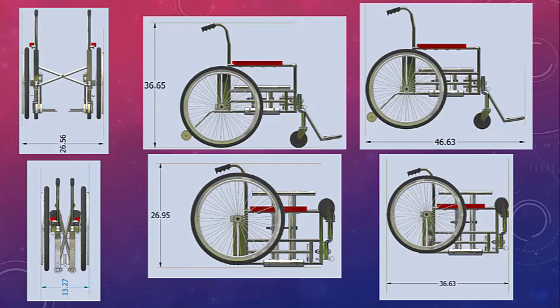The height difference between the collapsed and expanded is about 10 inches, which can be fairly significant when it comes to loading something like that into a car or small space. This dimension is nearly a foot shorter than other standard wheelchairs when collapsed, with standard wheelchair heights on average being 36 inches tall when collapsed.